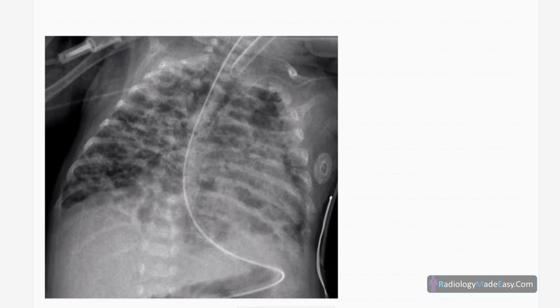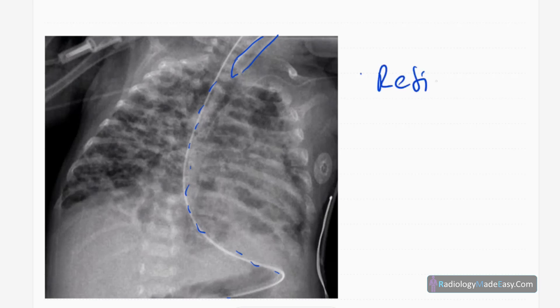This is the frontal chest radiograph of the neonate. You can see some lines — this is the NG tube, which is at the correct position, and also the endotracheal tube is there because the child is ventilated, and they are also at the normal position.